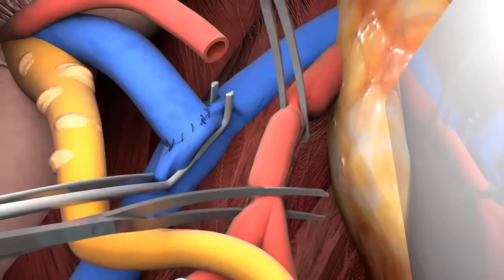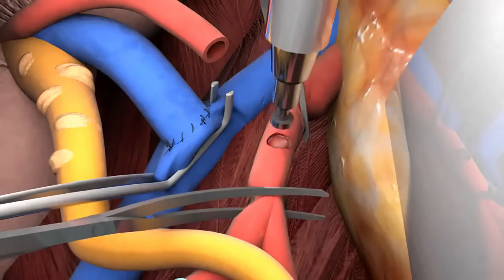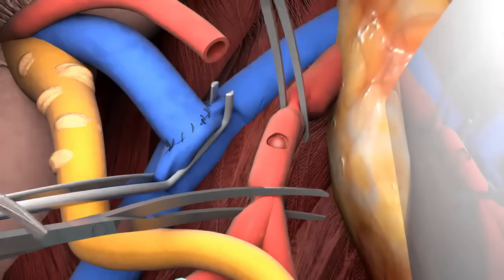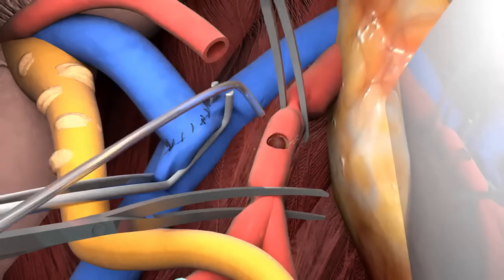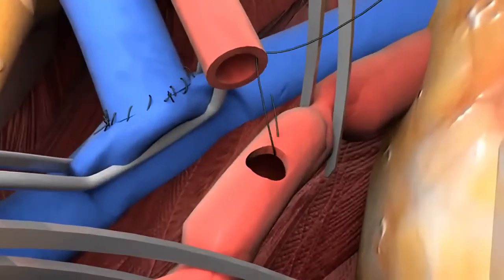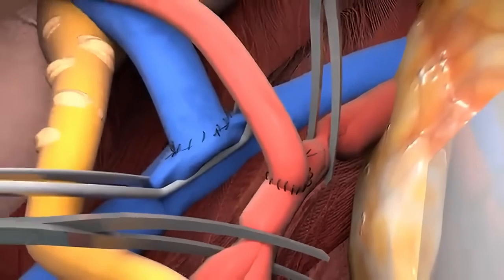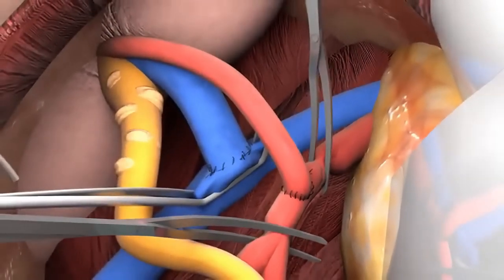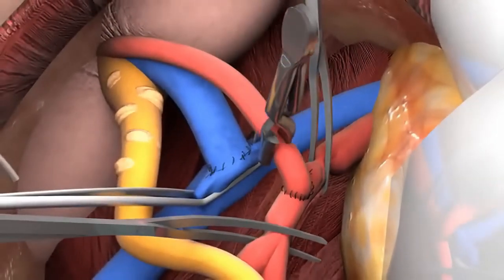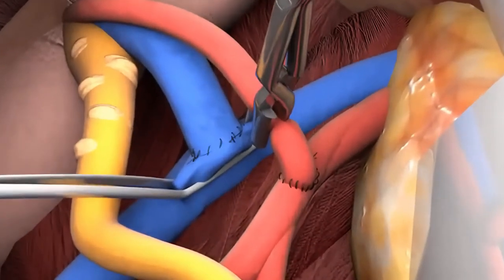Next, the iliac arteries are clamped. The artery, preferably the common iliac, is incised and the opening is enlarged using a 4 mm aortic punch. The artery is cleaned with heparin solution. The arterial anastomosis is now performed using a parachuted 6-0 unabsorbable running suture. Before reperfusion of the kidney, the renal artery is clamped close to the anastomosis. This is done to prevent blood clots to go into the kidney.